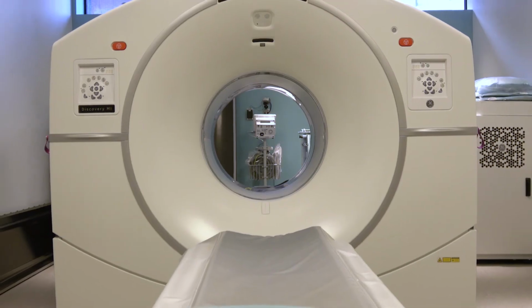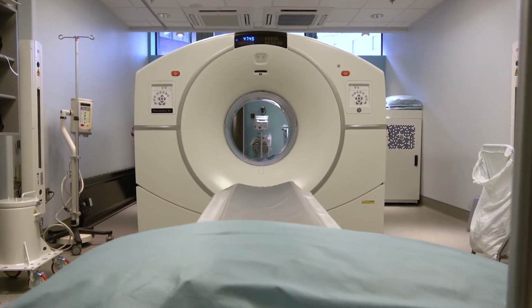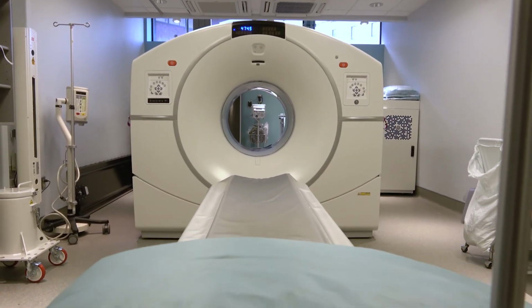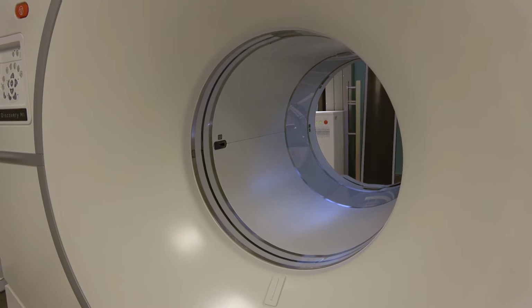So rather than having something that rotates around the patient, you've got banks of detectors that are arrayed in a ring around the patient, and they pick up that radiation that's given off when the positron meets with the electron and turns into energy. So the big difference between this scanner and the scanner that we had before is that instead of having 15 centimeters of those PET detectors, we've got 25 centimeters of those PET detectors. And that was the contribution that came from the Foundation.